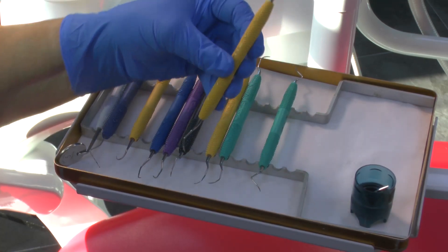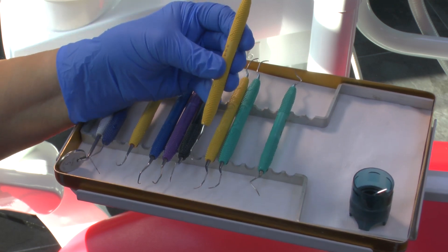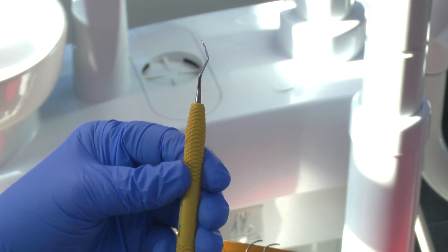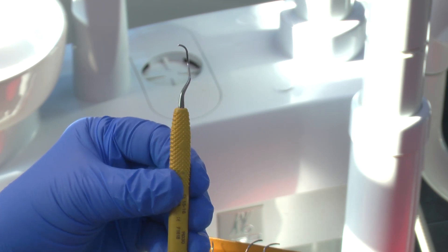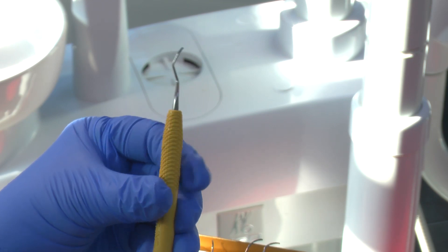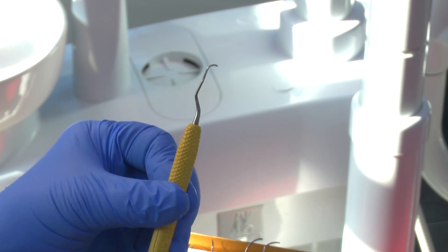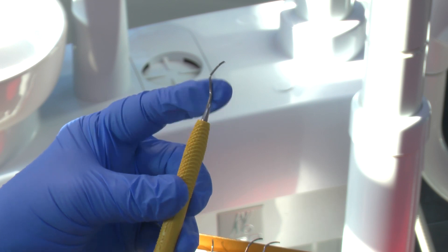This yellow one is for mesial surfaces — this is a Gracey 15-16. You might spot the difference: it's got even more of a curve on the shank, and that's for more posterior areas of the mouth, but again for mesial surfaces.